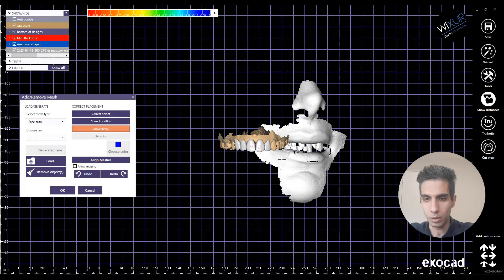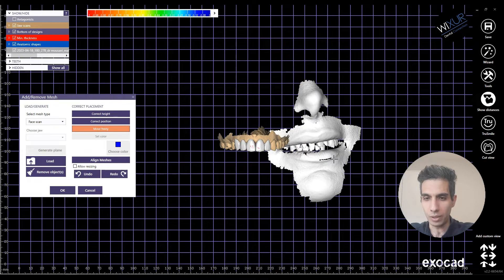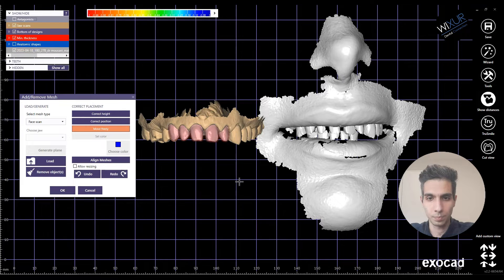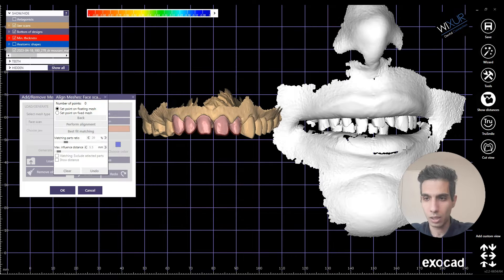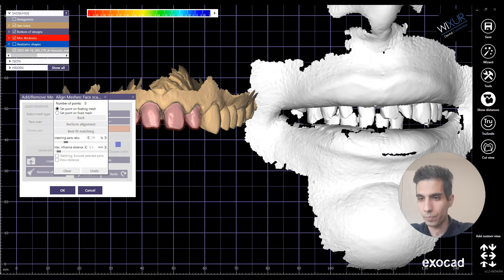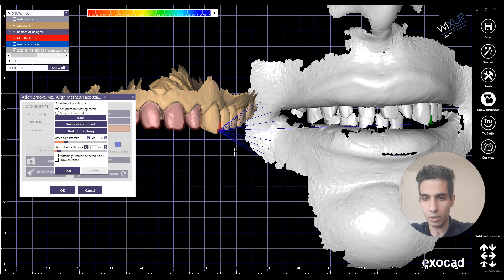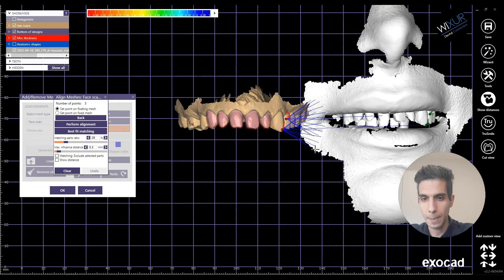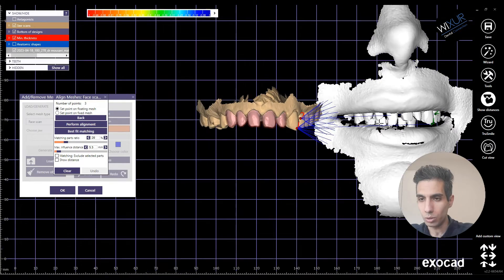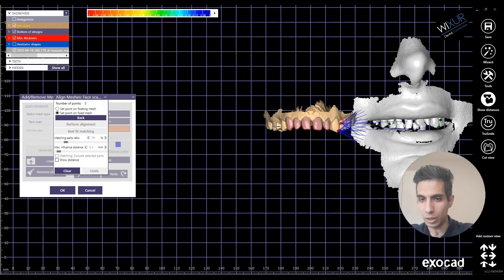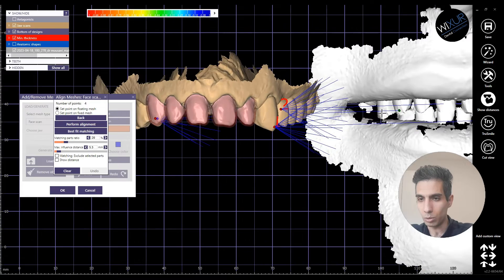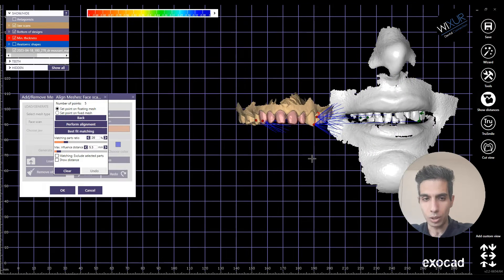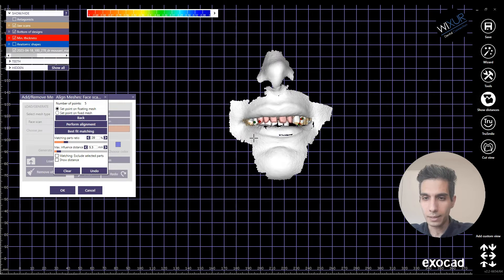What I need to do is choose some points that are almost exactly the same in both meshes, so the software can easily match these two meshes. Without the anatomic shape it's easier to align mesh. The first point I'm going to choose is on the tip of the canine here and also on the upper jaw, and a second point on the premolar. On the other side also I need to choose a couple of points — the tip of the canine is a good one, and also on the premolar.